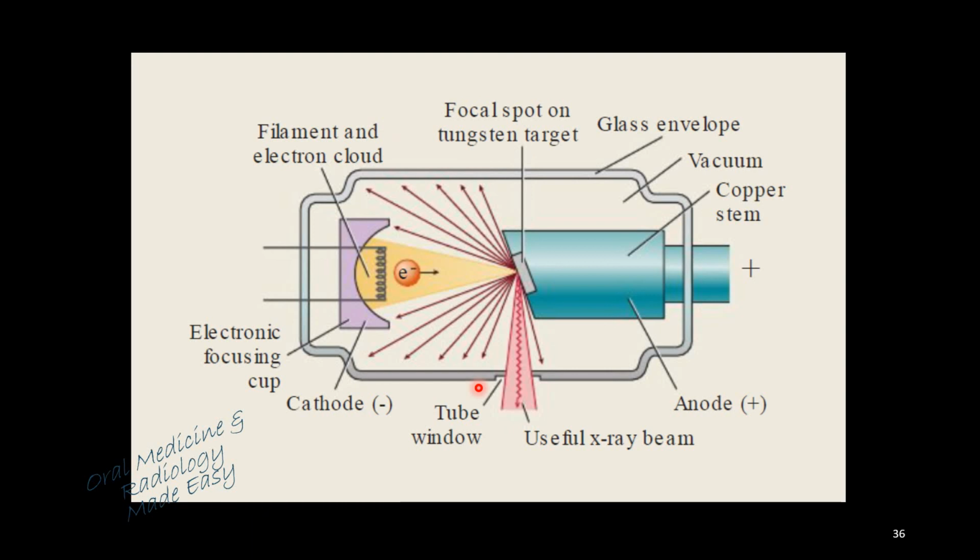Here there is a tube head seal and an aluminum disc. So at this part there is a tube head seal and an aluminum disc. This part is unleaded. Hence it allows X-rays to pass through it. The aluminum disc removes the longer wavelength X-rays, and the size of the beam here is restricted by a lead collimator. So this is how the X-rays are formed.